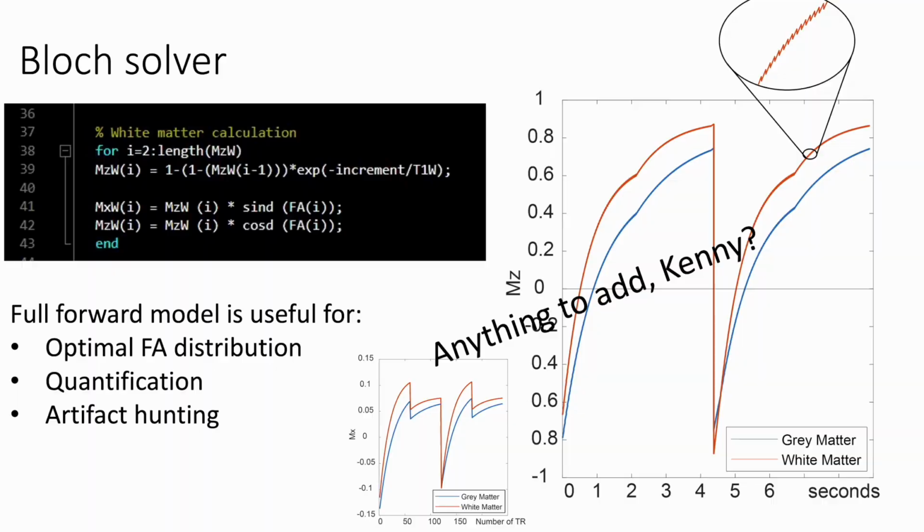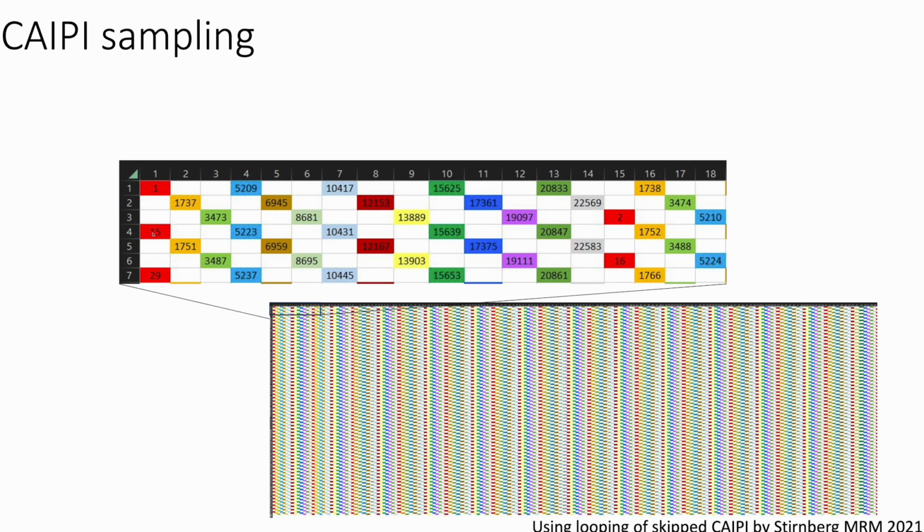Right. So here we fill our K-space. This is a graphic that Kenny generated. We have the entire K-space here with 250 slices. We have two dimensions. So the left-right dimension is the KY-T space. However, here we also have an additional dimension, namely the KZ-TI space. And the different color coding refers to the sampling scheme that we use at the end.